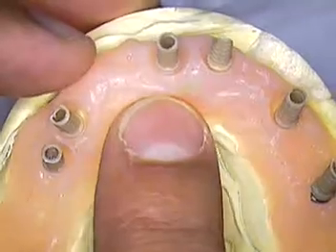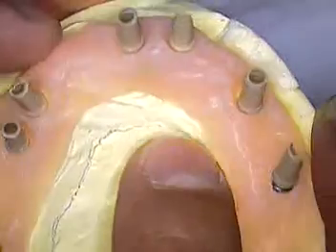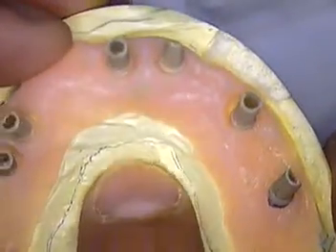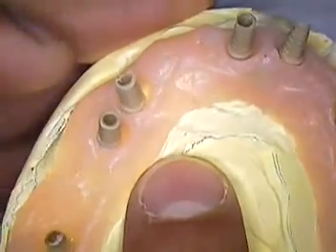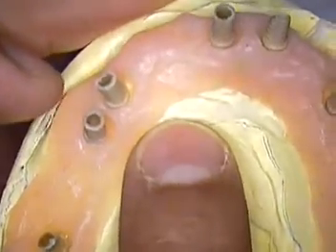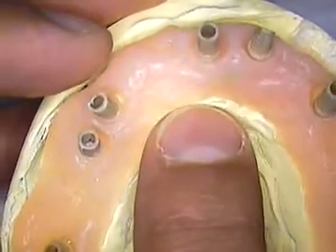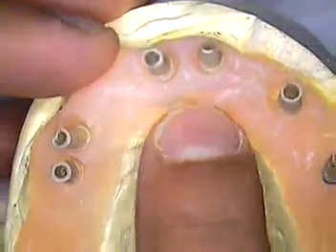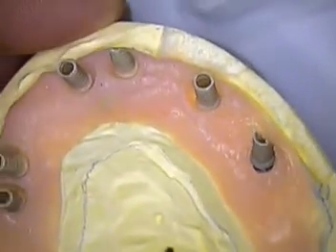We were thinking about doing all zirconia abutments and then going with separate zirconia frames, and you could do that. The reason we're not going in that direction is that if there is any discrepancy in seating, we want to be able to section the metal and maybe reassemble it. The other reason is there's no big aesthetic concern in this case, so we're going to go with strictly function and structurally sound. We do want to work on aesthetics, certainly, and we'll be very good about showing you the final work.